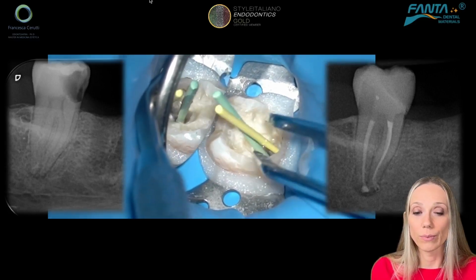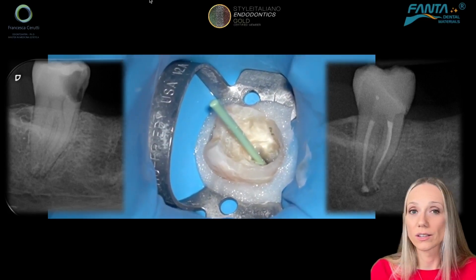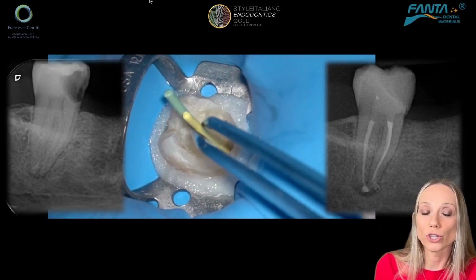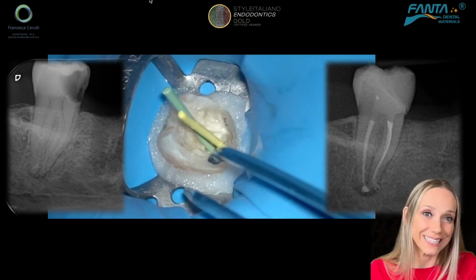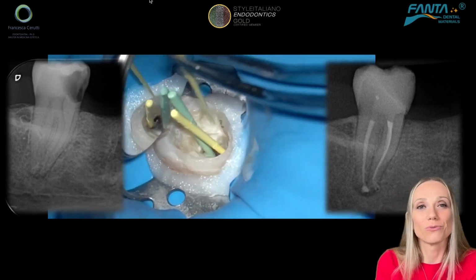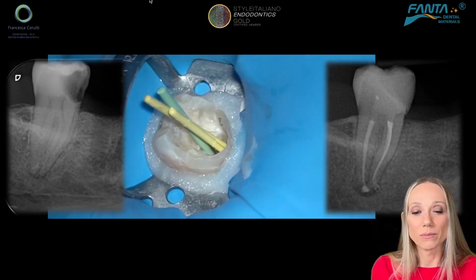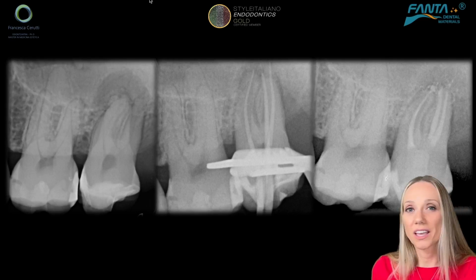You see, I'm completely in the phase of the obturation. So I check the fit of my gutta-percha point. I see it's too long, and so I cut a little bit. And then I put the gutta-percha point inside of the root canal again. This is an extremely important step. I'm sorry I keep repeating it, but it's so important. And so I want you to really mark down this concept. Do the tug back, try and check the fit of your gutta-percha points. And then once I've finished checking the adaptation, I can go on with my filling.